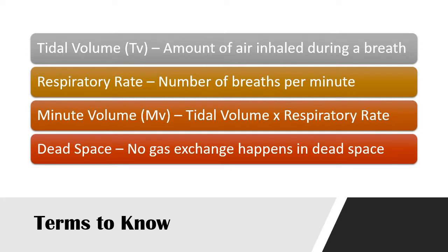Terms to know. There's a lot of them when it comes to talking about ventilator management, so bear with me for a few minutes. We're going to start with tidal volume. There's been a lot of changes in tidal volume recently in ventilator management, talking about lung protective strategies for tidal volume.